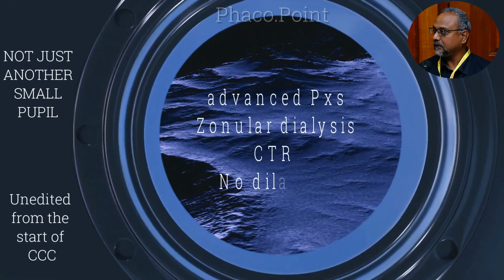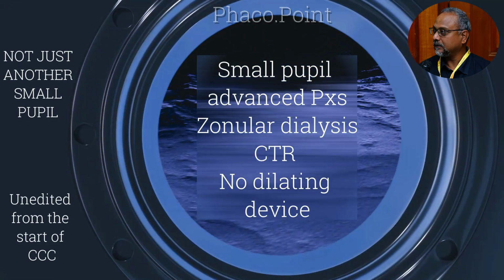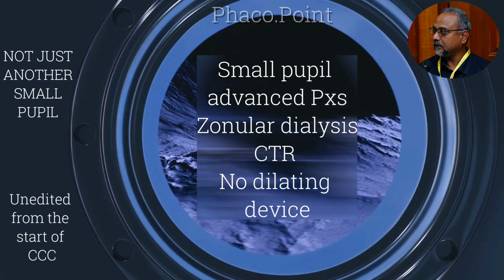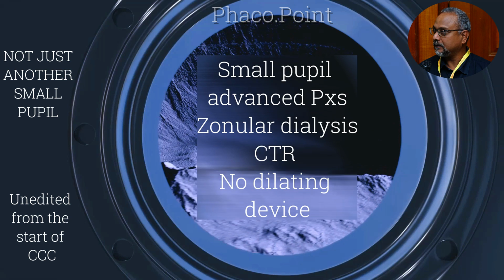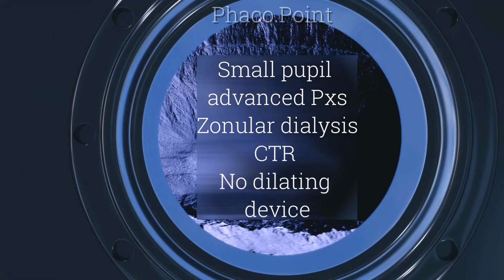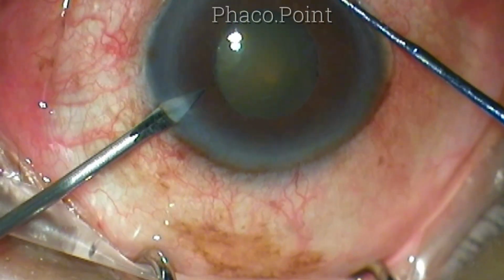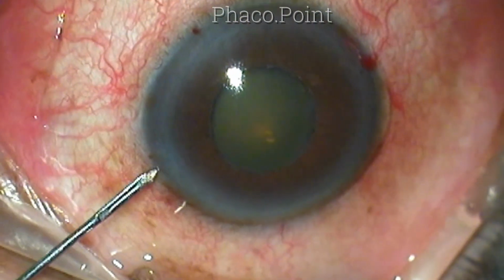Hello friends, this is not just another case of small pupil. In fact, the video is totally unedited from the time I start performing the capsulorhexis. There were small pupils and a very advanced pseudoexfoliation. The patient had zonular dialysis and I needed to use a CTR. And you can watch all this as the case unfolds.